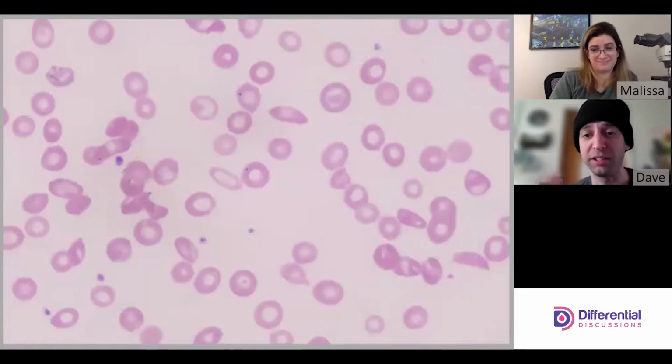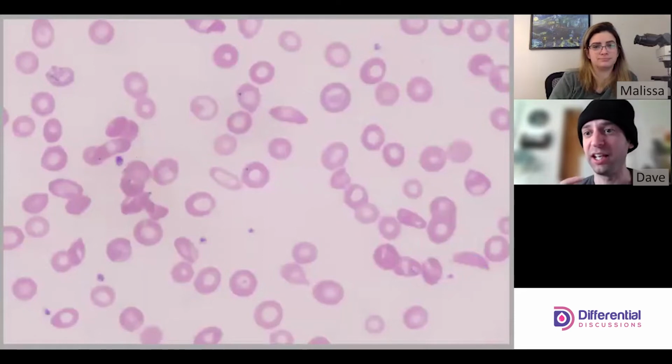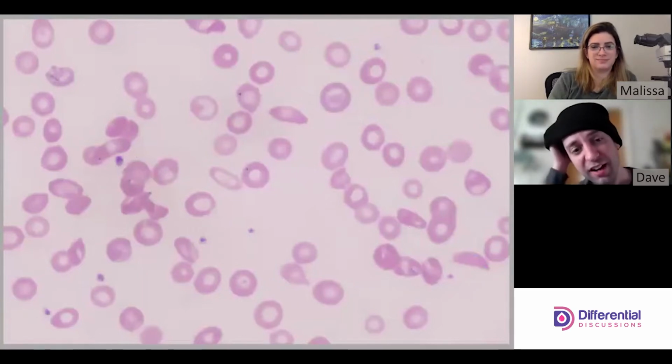We want blood cells to flow unimpeded through small capillaries and deliver oxygen to the tissues. Sticky cells are bad. These cause vaso-occlusion, which further lowers oxygenation to the relevant areas. A lot of what makes sickle cell disease so bad is that it runs away, right? It's that snowball effect. Definitely. So not uncommon to see some cells sticking together like that.